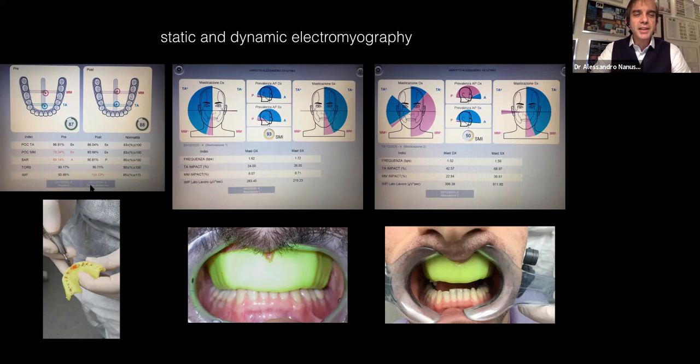After the balance, you can see here in Italian, paradenti bilanciato, mouth guard balanced. You can see all the signs, all the percentages are black, so they are in the perfect target, and the impact is 134%. So the power of the patient is improved. His brain tells his muscle, clench and go away. It's perfect. You can recruit. You have no inhibition. So this is very useful for the patient.